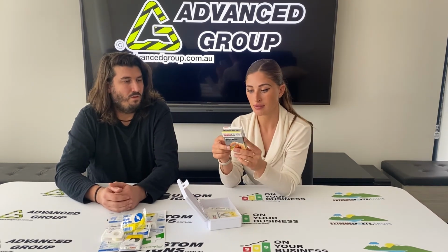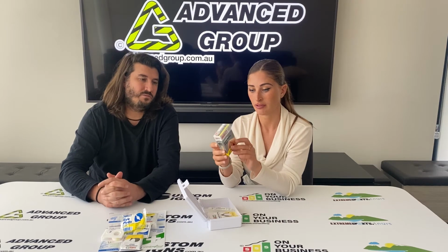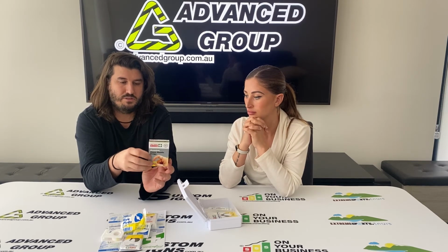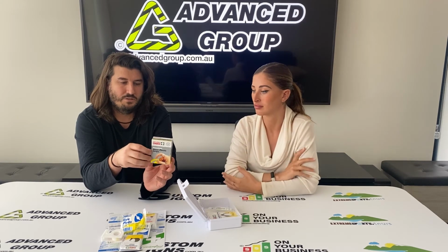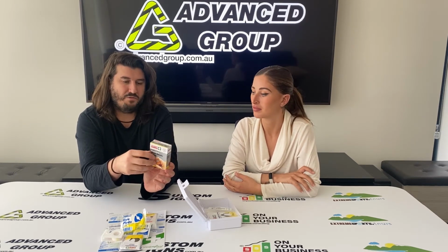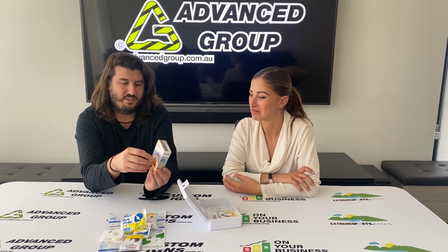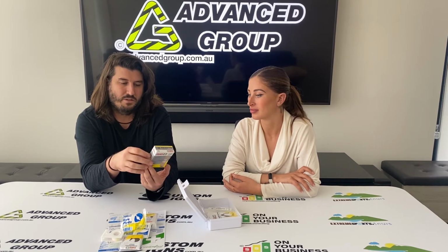Bandages, obviously. So the generic term is Band-Aid, but we're not allowed to use the word Band-Aid because it's trademarked by Johnson & Johnson. These are the equivalent. So they call them plastic strips. Every company that makes an equivalent of the Band-Aid will call it something slightly different, so they don't infringe on copyright. They've called them premium sheer plastic strips. And that's a 50-pack.